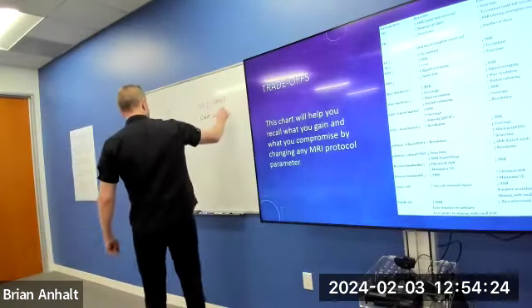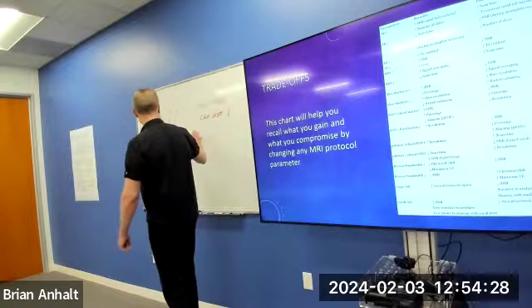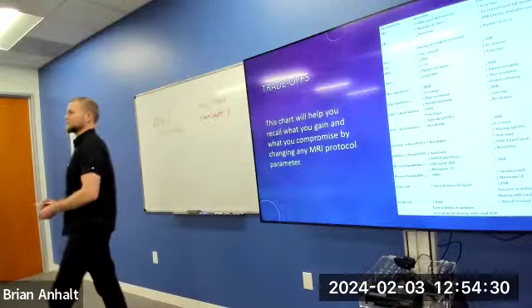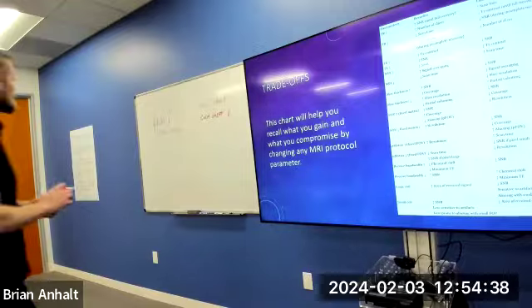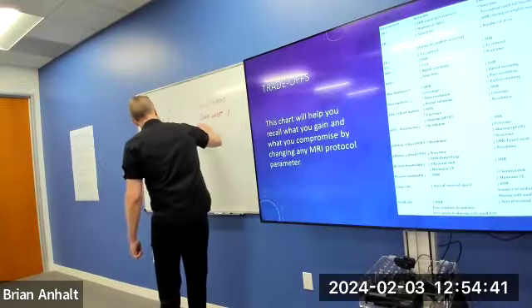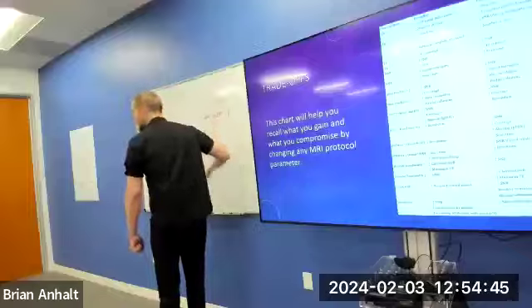The chemical shift artifact goes away or decreases. Anything else happen? Sample time goes down, therefore my minimum TE goes down, remember?